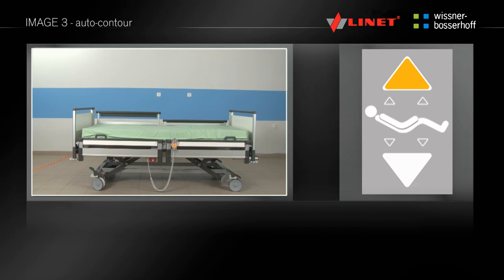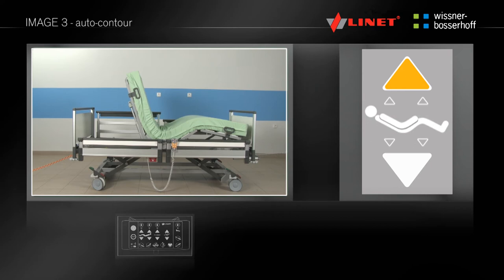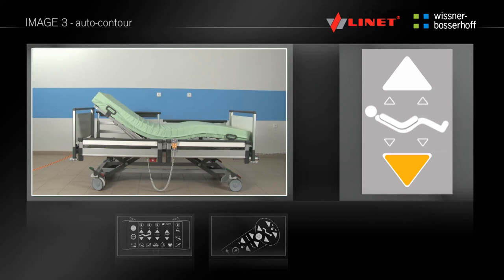To activate the auto contour function, press the go button. By pressing and holding the appropriate button, you can set the desired position. The auto contour positions the backrest and the thigh part simultaneously. You can set this function on the supervisor control panel and manual control.